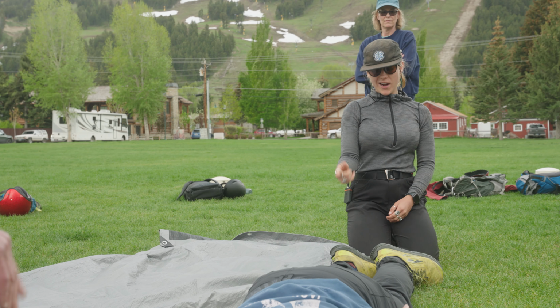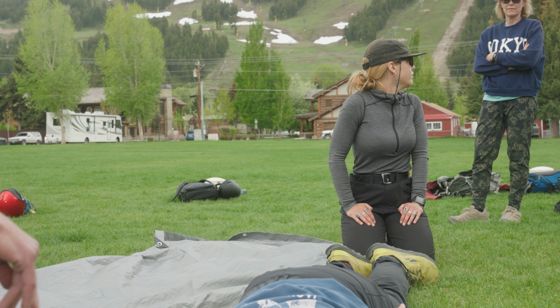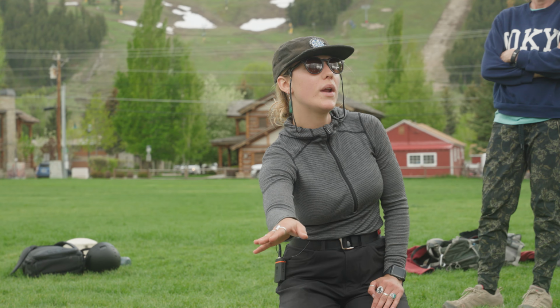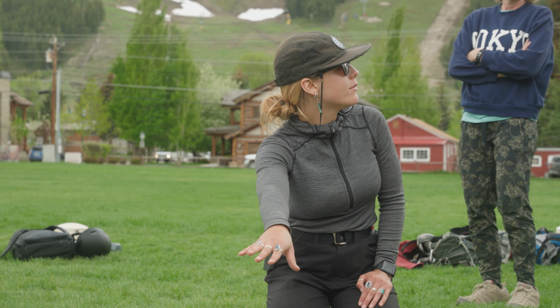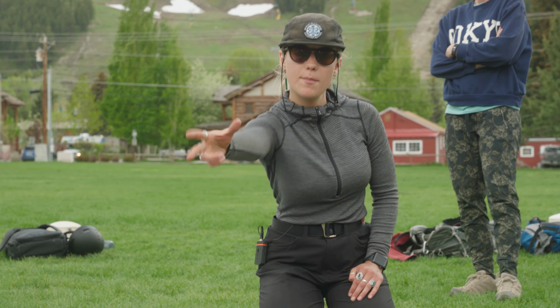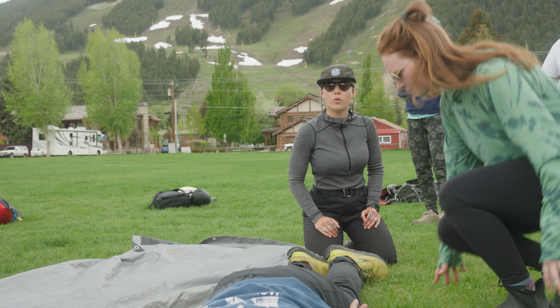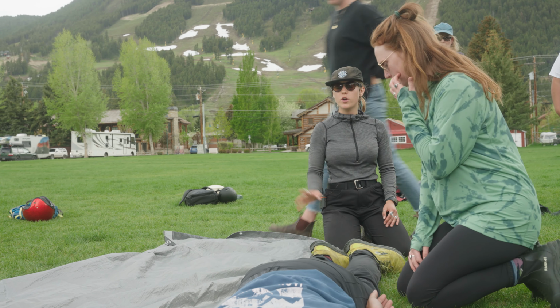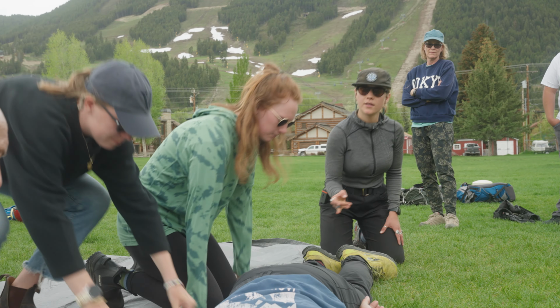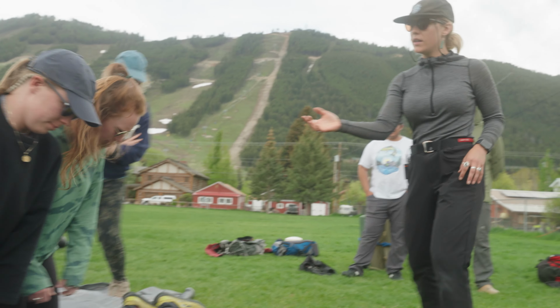Now, why did we roll the tarp? Yeah, so once it'll be a great handle, absolutely. But when I roll my patient over, now they're gonna be in the center of the tarp. So now what I'll do is I'll have 3 people come on in and be on the side of the patient like they're gonna do that log roll. So which way are you rolling the patient? Onto the tarp, exactly. We're gonna need one more person to come on and rescue, and you'll slide on up.